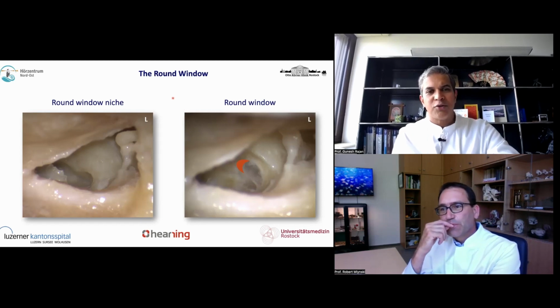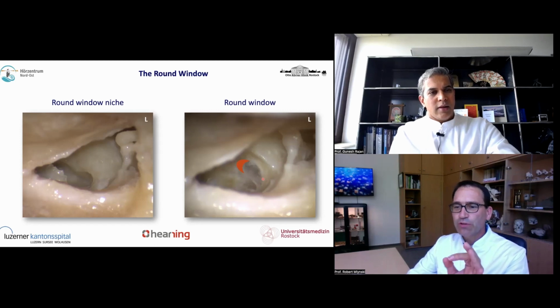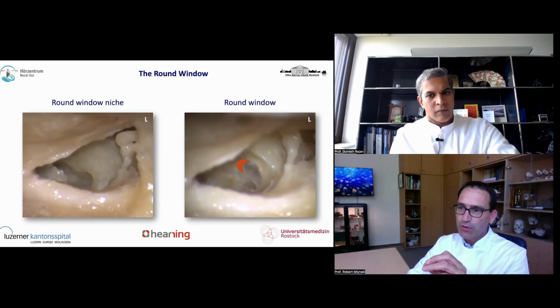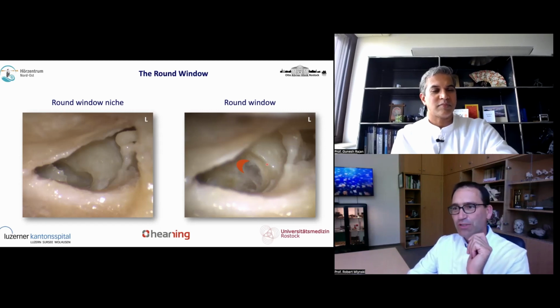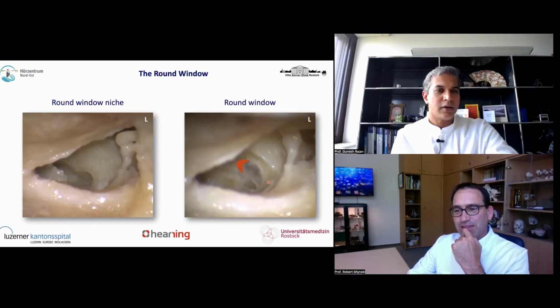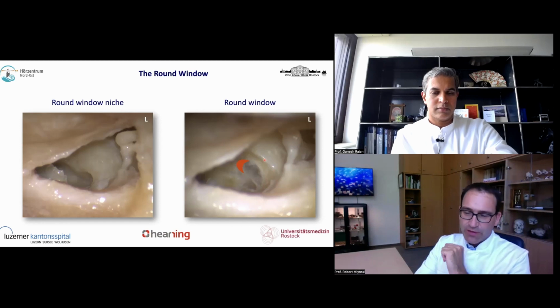All right, so we've exposed the round window membrane. So what's next? Yeah, if you mentioned the round window positioning of the FMT, it's important not to touch the membrane with the burr. Because if you have residual hearing, in a VSB this is even much more important, because maybe you kick the patient out of a cochlear implant indication if you touch it. Yes, of course, you don't want to induce a sensorineural hearing loss by drilling. Yeah. Slow rotation. You can use a skeeter, for example, works fine.